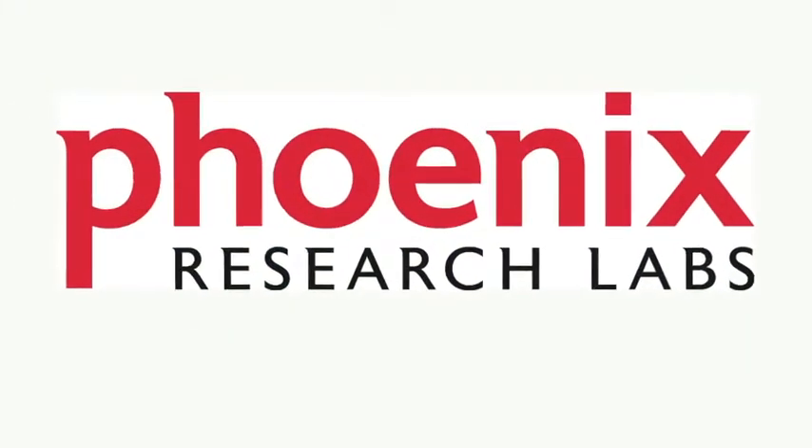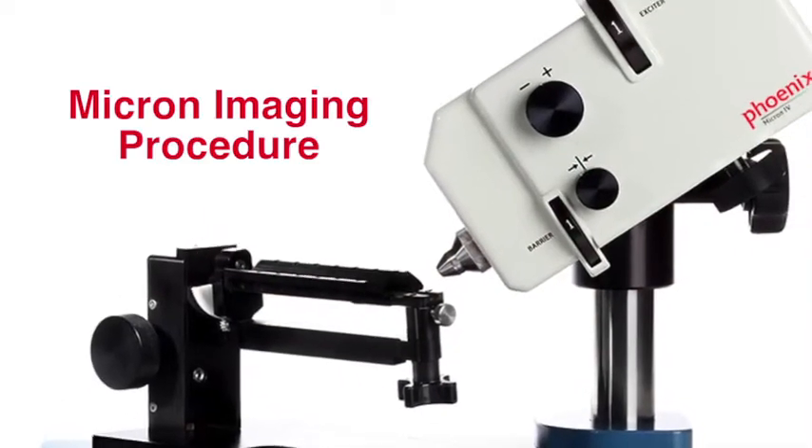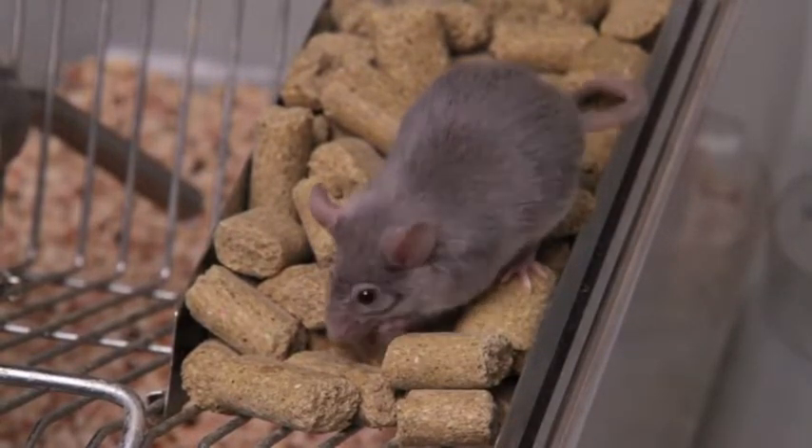Phoenix Research Labs brings you the Micron Retinal Imaging Microscope, designed specifically for small research animals. We'll show you how to prepare and image a mouse.